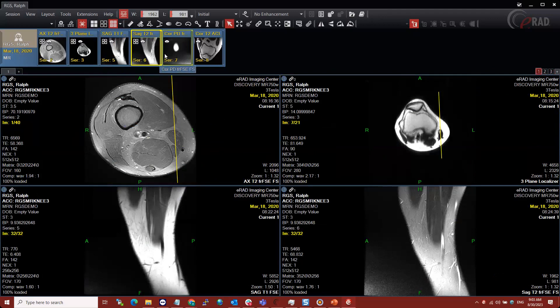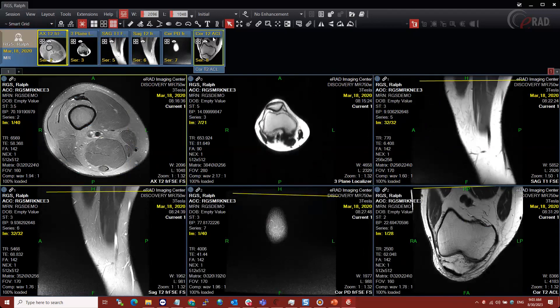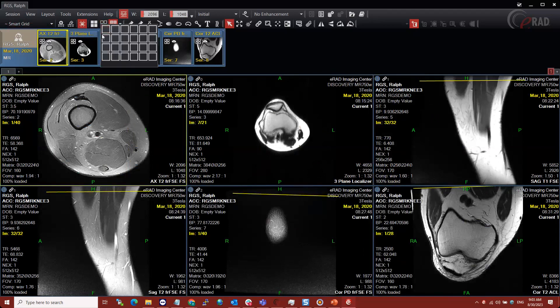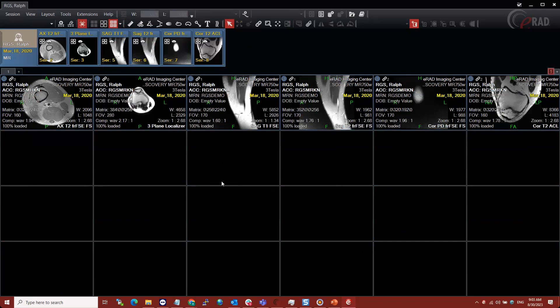Let's go back to creating some basic generic hanging protocols. Most people don't want to use Smart Grid. All it really does is look at how many series you have and divide the monitors up in a reasonable pattern to fit every series on screen. You see everything within limits — there are limits to how small images can get. Once you hit the max, Smart Grid won't go any bigger. You're looking at almost thumbnail-sized images, and if you have more series than fit, you'll just get virtual monitors.